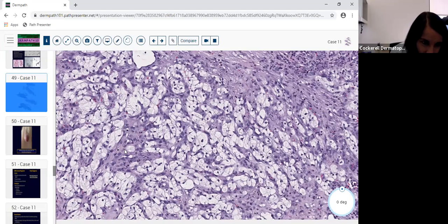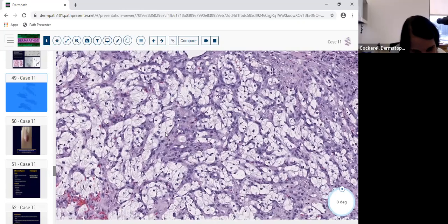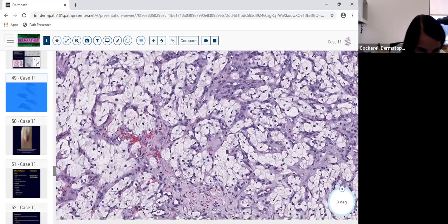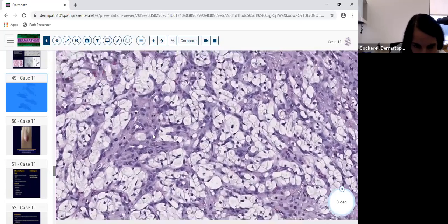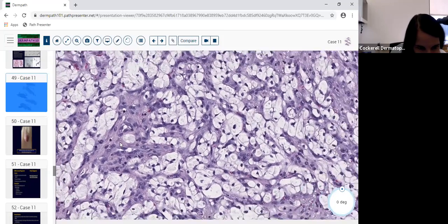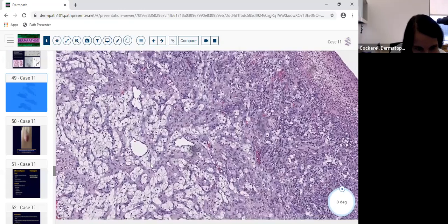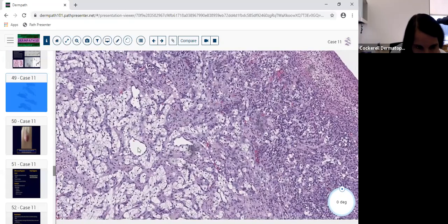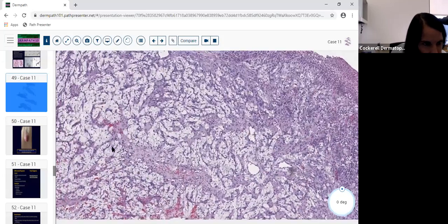And we have these clear cells, and we have this network of vessels. These cells in here, those are dead center. If you don't see my arrow, I'm not sure if you can see my arrow. These are a network of arborizing vessels, and you see extravasated red blood cells here. So if you wanted to, you could stain it with CD34 and prove that these are actually endothelial cells and not inflammatory cells. Also, if you look on low power, you'll see large ectatic capillaries, which helps you decide, yep, there's a vascular stroma here, which is extremely important.